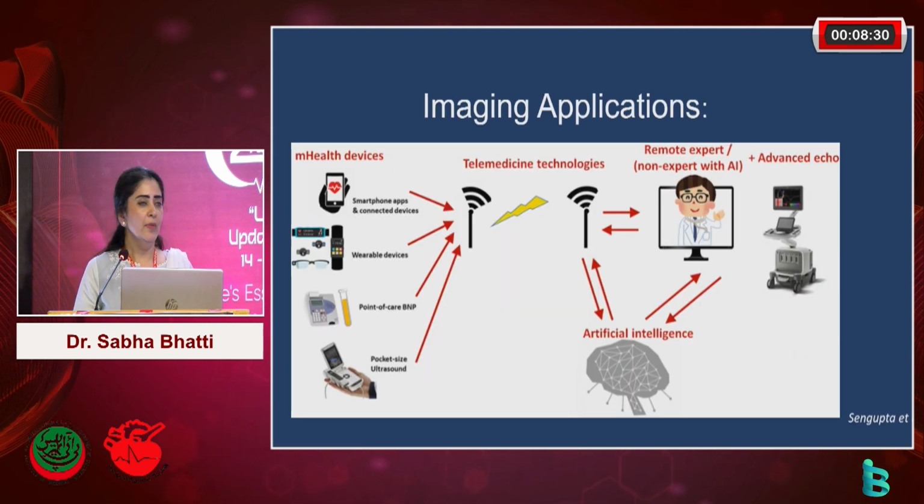And so echo, especially 3D echo, as I'm going to show you in some cases, has really become the cornerstone of structural imaging. It's used for the planning. So initially, when you're doing your annulus sizing, not every patient can get a CT with contrast. They might have kidney dysfunction. You could use a 3D TEE to do that. For the ASD planning, for the size of the hole, as well as whether there's an aortic rim, a posterior rim, you need it. For the mitral clips, it's for deciding if it can be closed using a clip, if it's primary or secondary MR, where exactly the leak is.